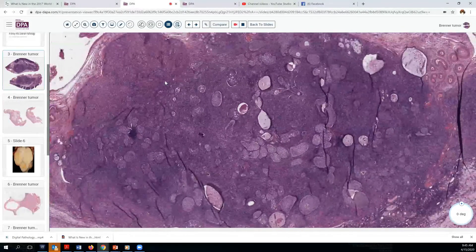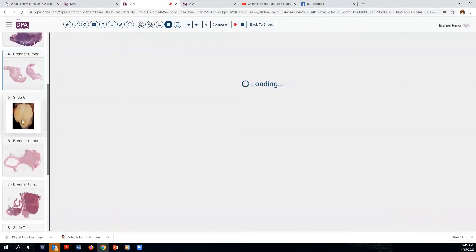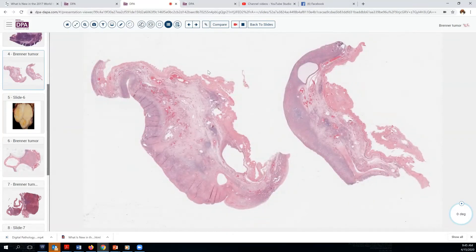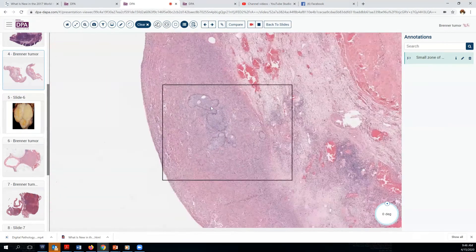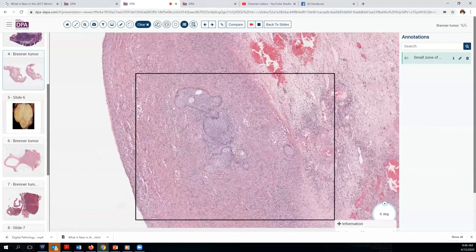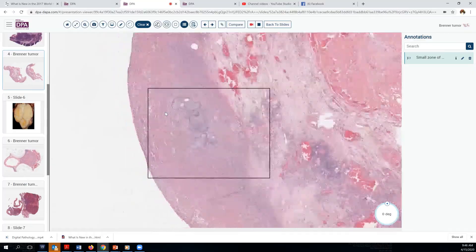This is a fairly typical size — a couple of centimeters — but these lesions can also be really quite small. Here's a case where you might actually gloss over and miss it if you weren't looking closely. There's slight abnormality here and here. Looking at the annotations, you can see that again we have a nested pattern of epithelial cells with some central cystic change, eosinophilic secretion, surrounded by a fibromatous stroma.